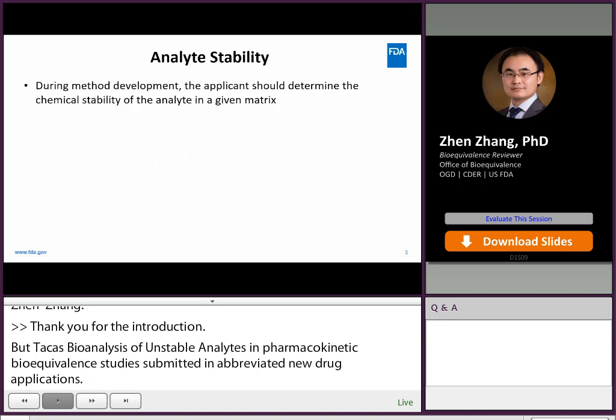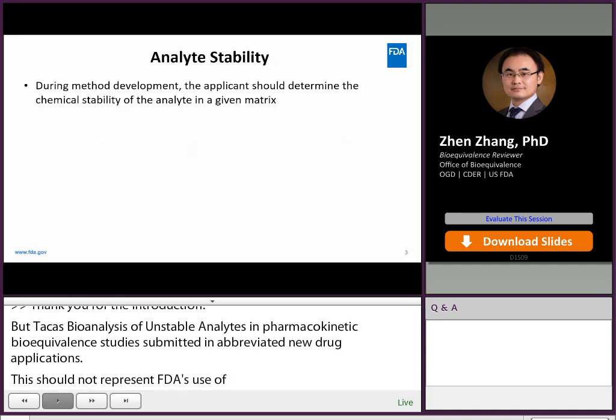The measured analyte concentration should reflect the true systemic analyte concentration. If the analyte is unstable and the applicant does not take precautions to stabilize the analyte, the measured concentration may lead to overestimate or underestimate of the analyte concentration in study samples. Therefore, during method development, the applicant should determine the chemical stability of the analyte in a given matrix. If the analyte is unstable, the applicant should take precautions to stabilize the analyte.